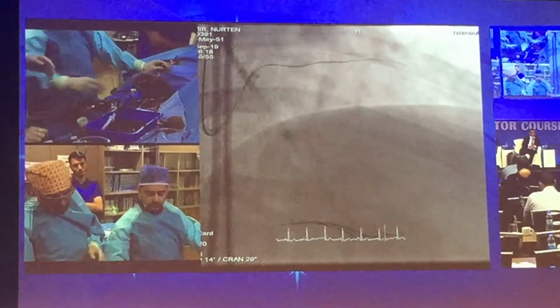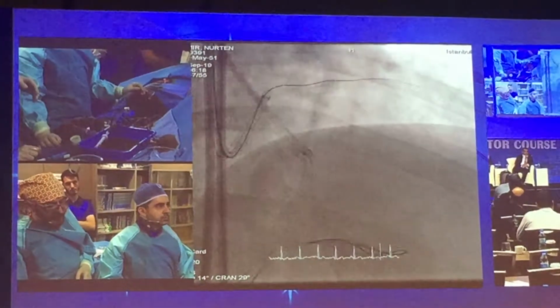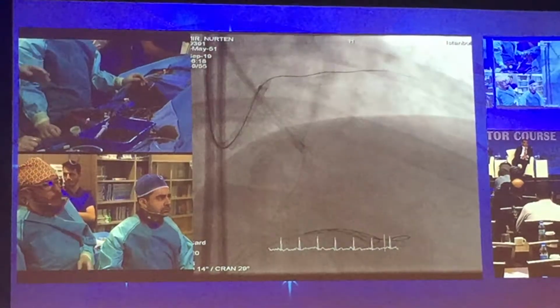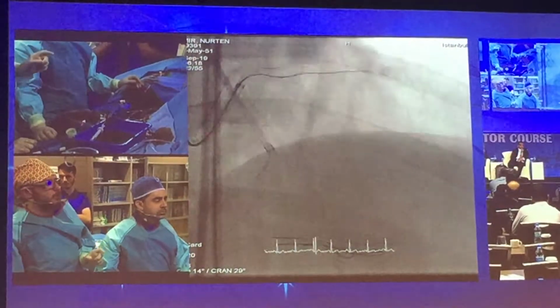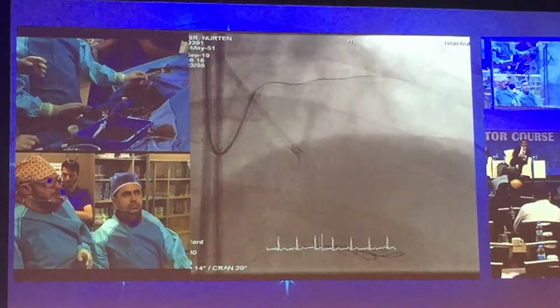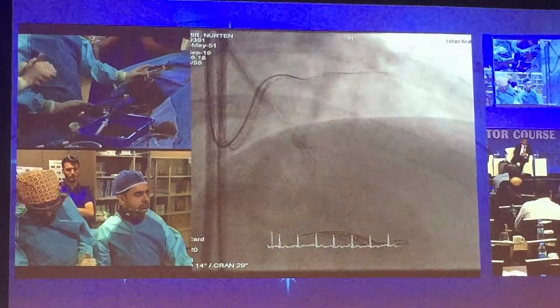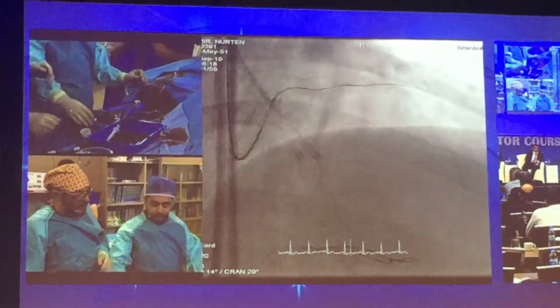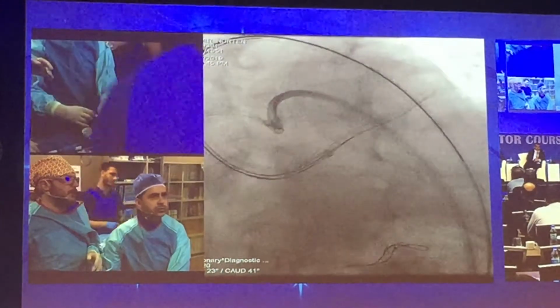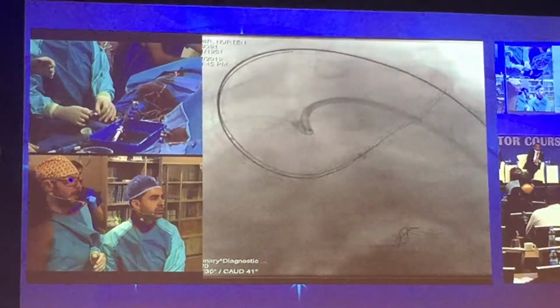So we had no option but to revert our strategy to a parallel wire technique. We also had some information about the lesion. This is an in-stent CTO, but the CTO begins one or two millimeters before the stent. It is not just in-stent CTO. So our next strategy is to go with a Conquest Pro 9 wire. We have given a second shape again to the wire, and we will try to puncture from a different side, a different beginning now. Contrast.